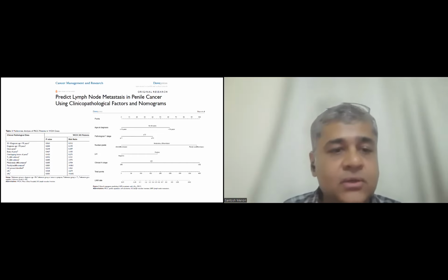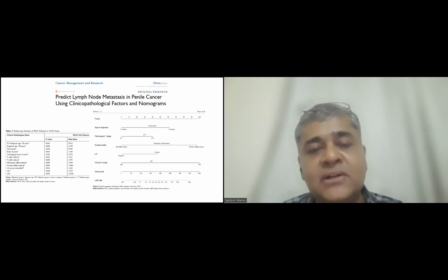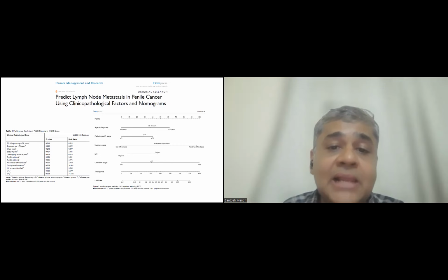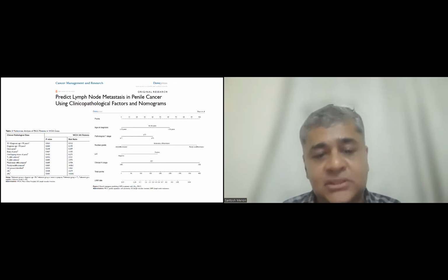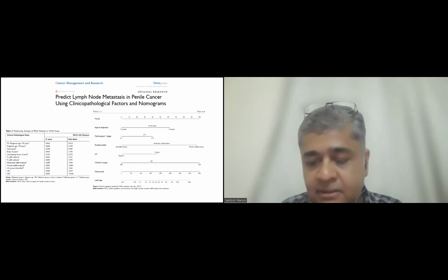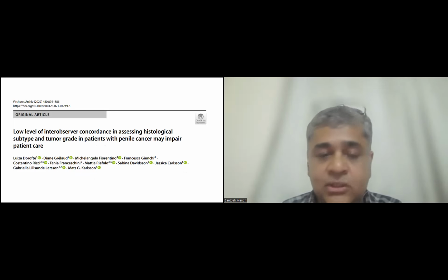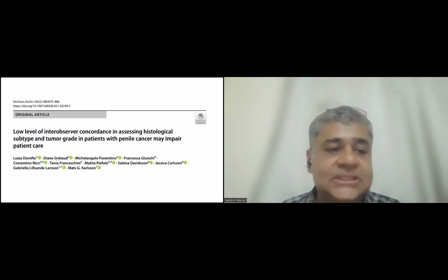You have to educate your clinical people what a pseudoglandular means, what a pseudohyperplastic means, and those will help them understand and integrate the value of histological subtyping into this. But currently, many of these things don't have that. Obviously, there is a low level of inter-observer concordance in assessing histological subtypes.